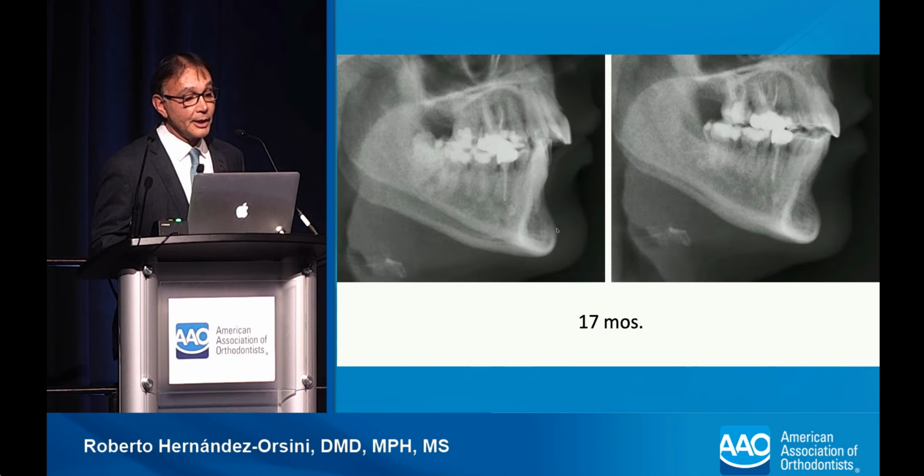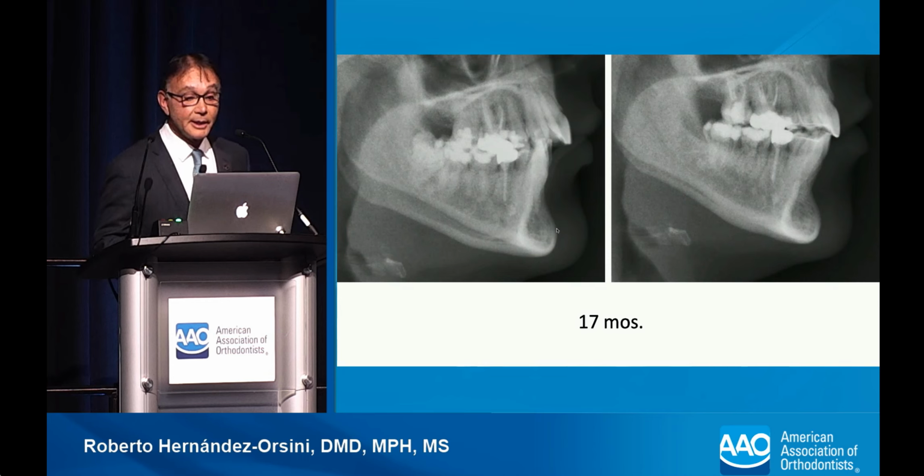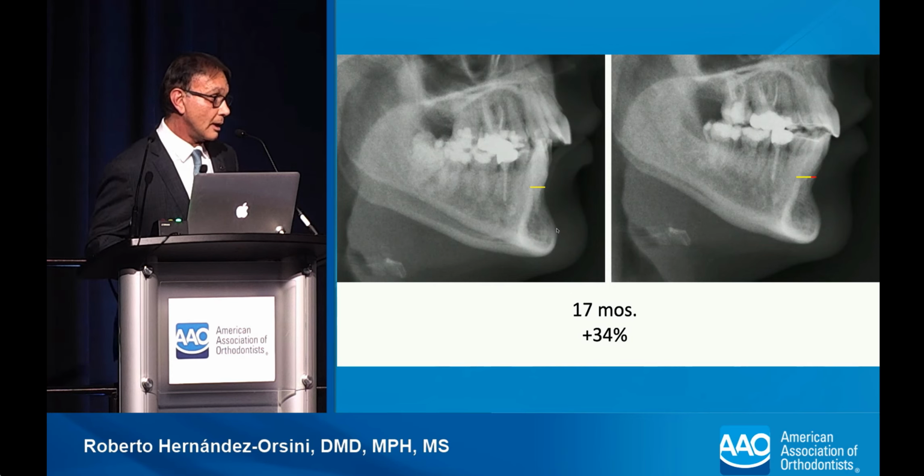And you can see here a close-up of the cephalometric symphysis area. So we improved 34% of bone on B point with this procedure.